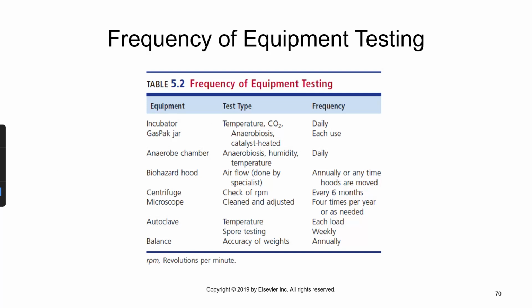So here you can read through some of the frequency of equipment testing. Every lab is going to have a very particular protocol of how frequently equipment needs to be tested, but you can pause the video and take a look at each of these. And then when you do get a job offer and you become a medical lab tech, when you're on the job, you can see their own QC logs, and it will tell you right on the QC log how frequently it has to be done.